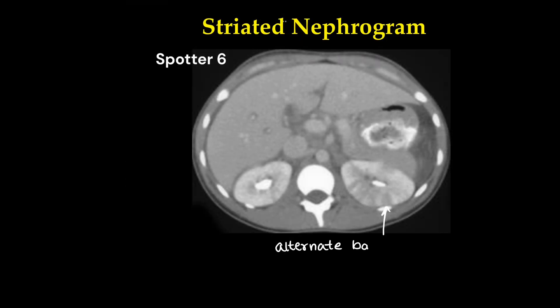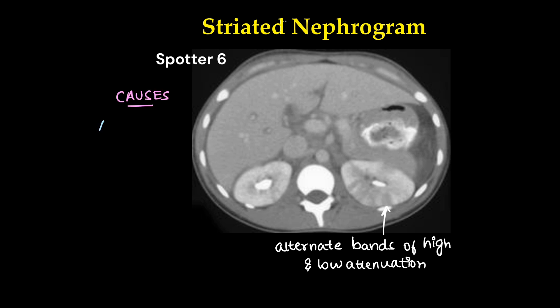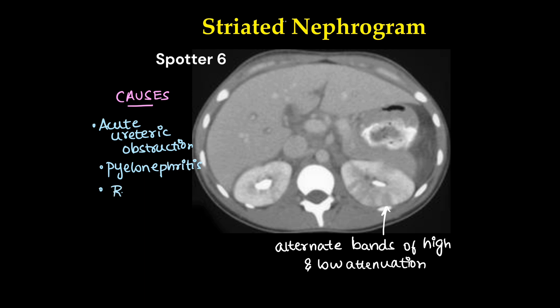This is a striated nephrogram. We can see alternate bands of high and low attenuation on CT, especially in the nephrographic and urographic phase. This happens in acute ureteric obstruction, pyelonephritis, and renal vein obstruction, among many other causes.